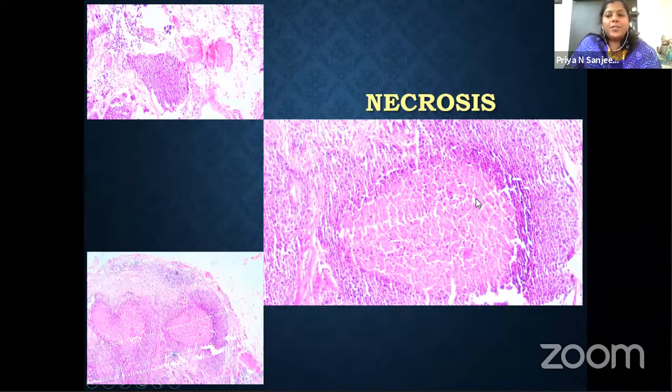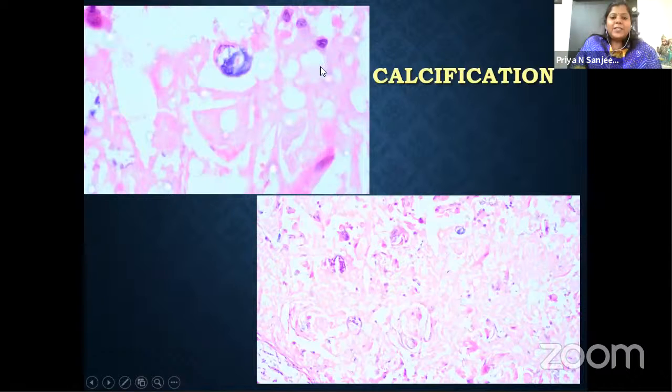Lymphoid necrosis is different from lymphocytic necrosis. Lymphoid necrosis is an area where many cells are involved. And lymphocytic necrosis means individual cell necrosis, or we can call it apoptosis. Best example I can give is the mummifying cells that we see in Hodgkin's lymphoma. It's a form of lymphocytic necrosis. Sometimes the necrotic areas can show dystrophic calcifications, which are blue in color.